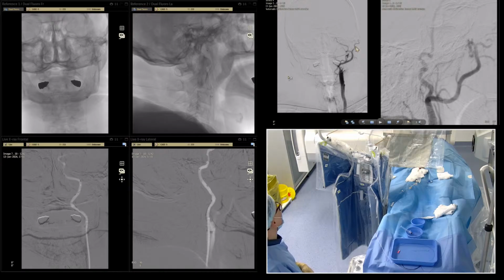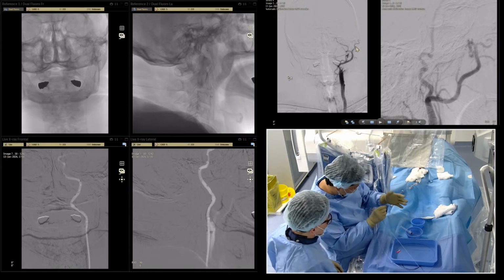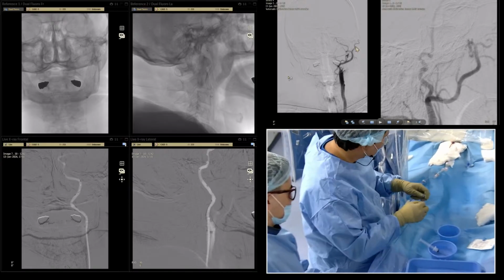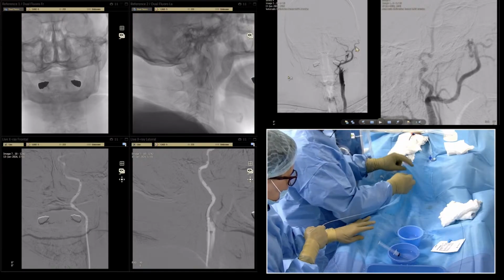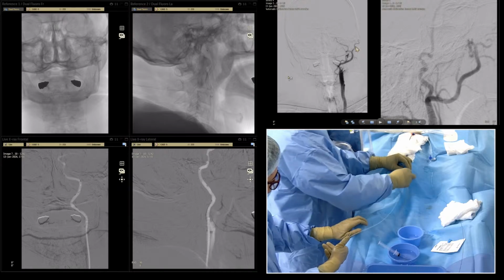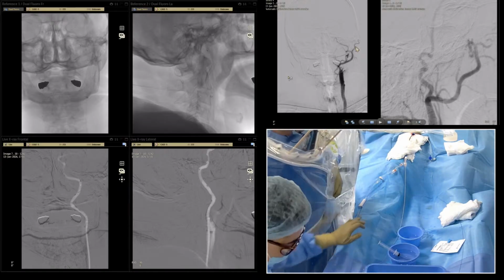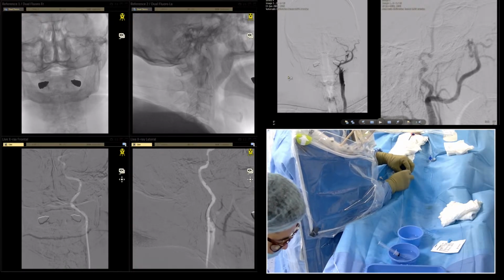Okay, we gave a little bit of angulation, 45 degrees. Let's see. One more alternative could be the balloon catheter from Impress Medical, or yes, Impress is most suitable for this situation. 125 centimeter. Impress works very well.